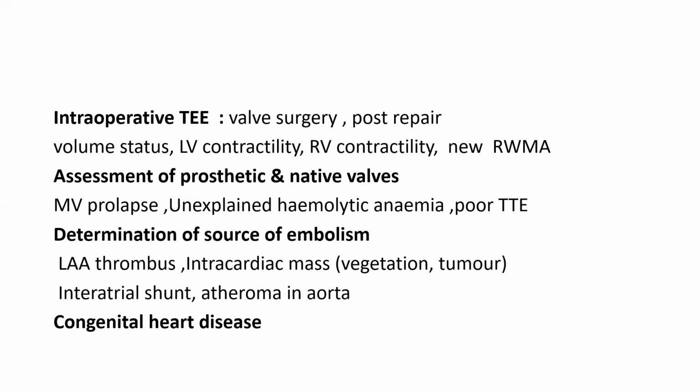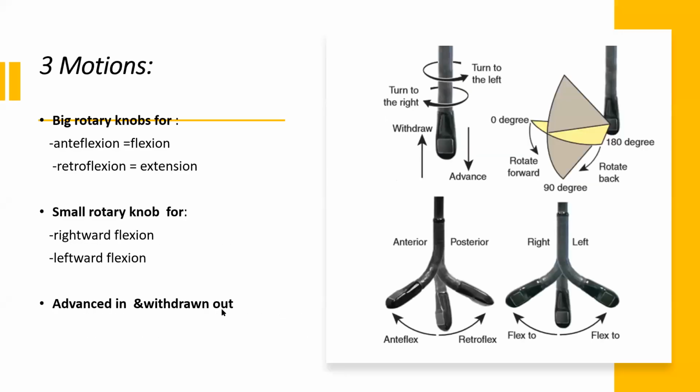If the patient develops problems and they cannot wean him from bypass, you need to do TE to see any regionality, to see the RV function, LV function, to assess the mechanical valve, native valve, mitral valve prolapse, especially whether it is repairable or not. Source of embolization: the neuro people always refer patients to us to rule out the source of embolization. Congenital heart disease. Let us go to the business.